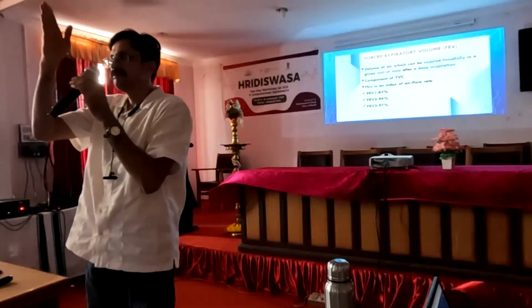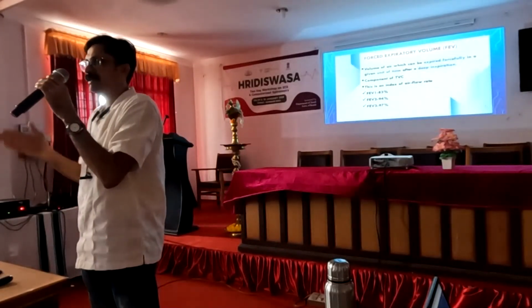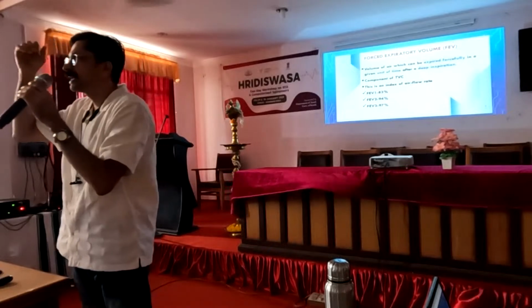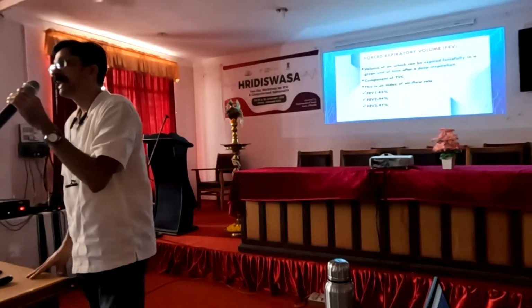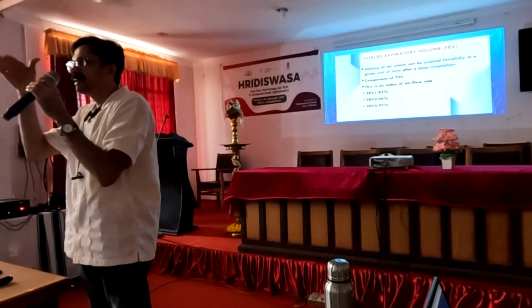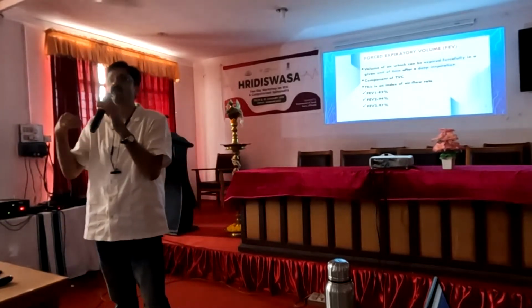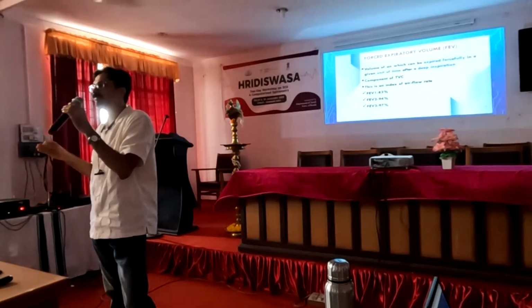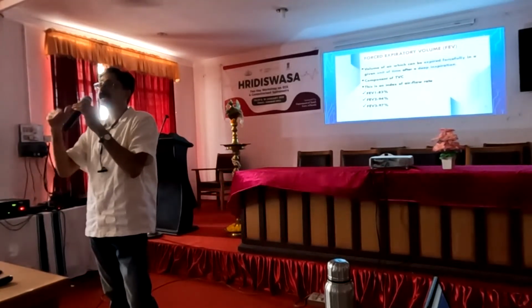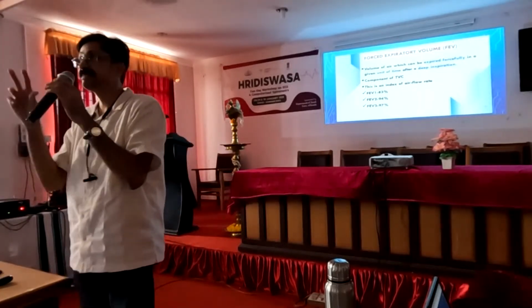So we can divide this into the first second, second second, and third second. That's the maximum volume of air that is breathed out in the first second. The end of the first second is FEV1. The end of the second second is FEV2, forced expiratory volume 2. And at the end of the third second is FEV3. So at the end of the third second, all the volume of air is breathed out. It will take 3 seconds.